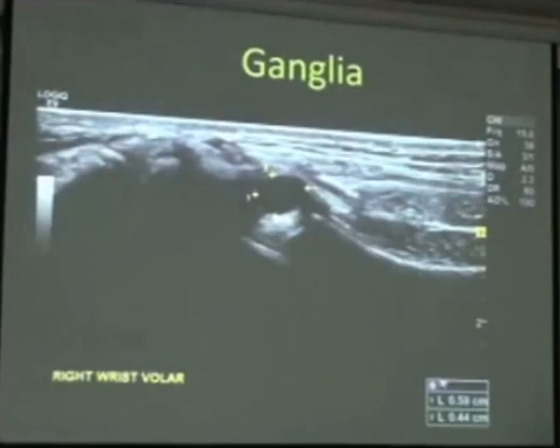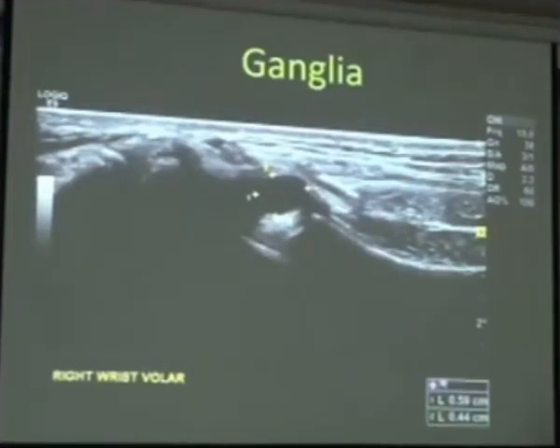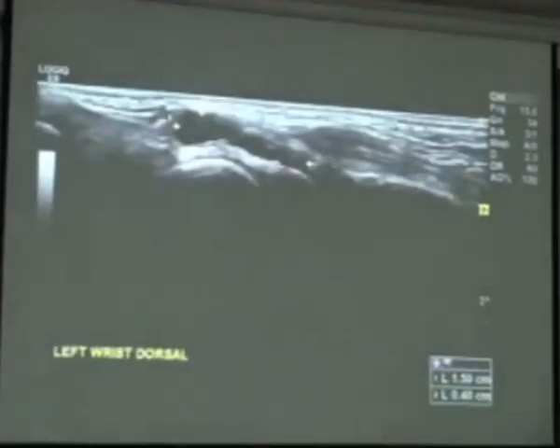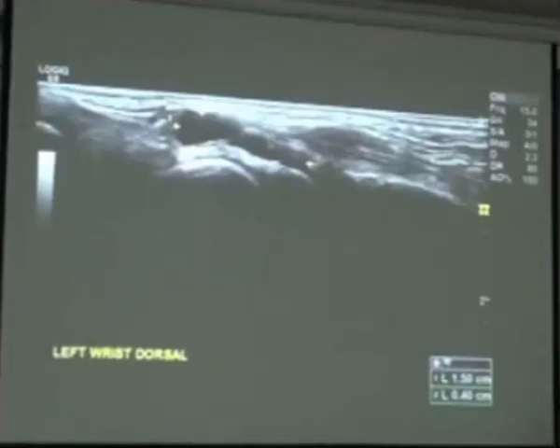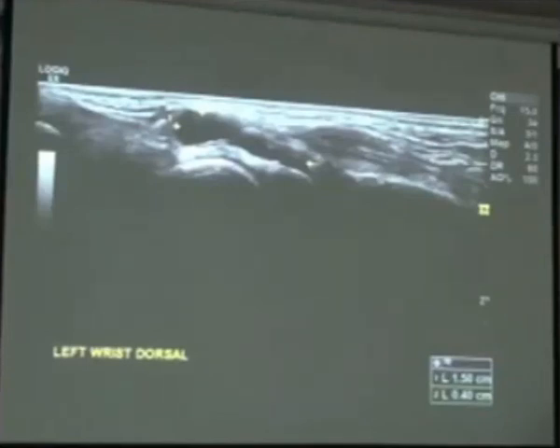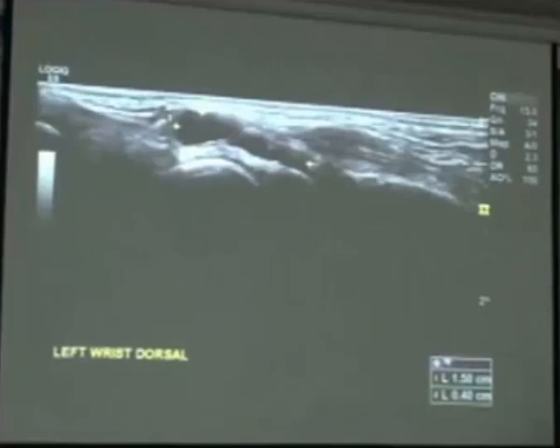Another common finding in the wrist is ganglia, which can arise from either a tendon sheath or a degenerative joint and have variable presentations. What we commonly do is inject the ganglia to try and rupture it, using local anesthetic and steroid. We've found there's about the same recurrence rate doing it with an injection as opposed to surgery.